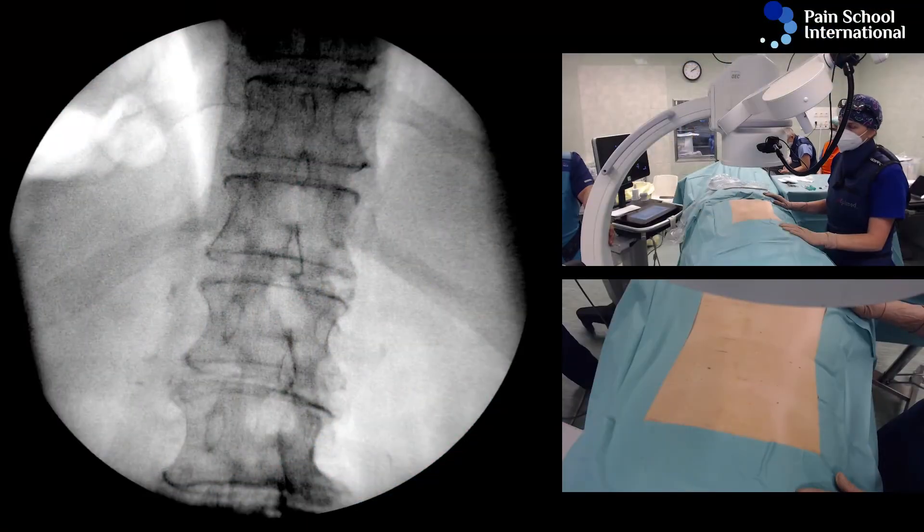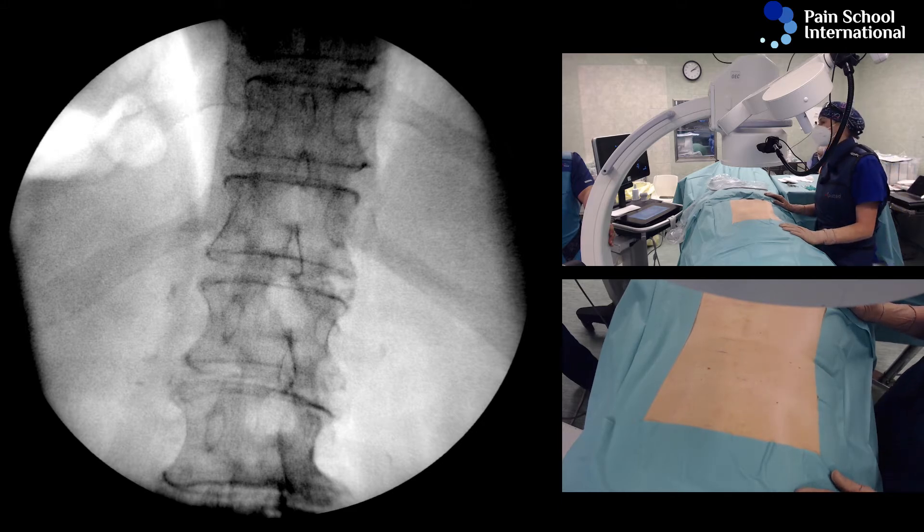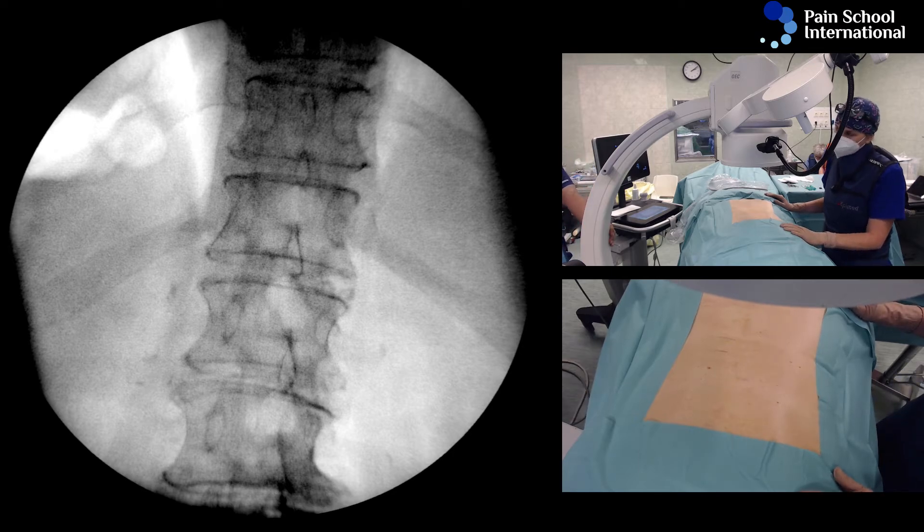There are really many ways of doing the procedure and they all could be right, and there's always an ideal way. You could use ultrasound, which is better in some cases, and you could use x-ray, which is easier in some cases.